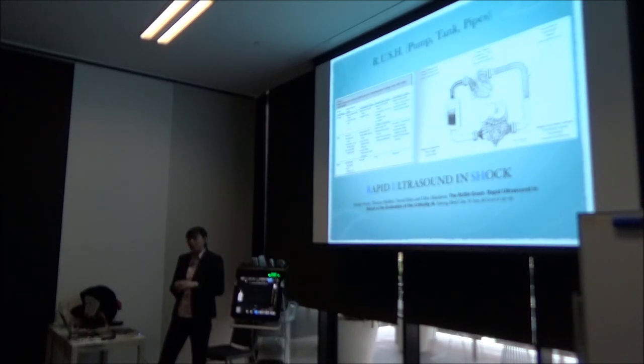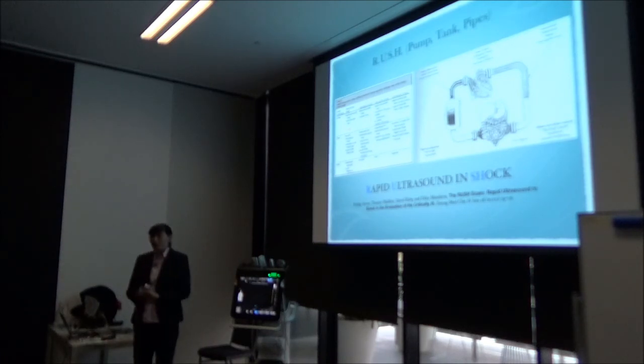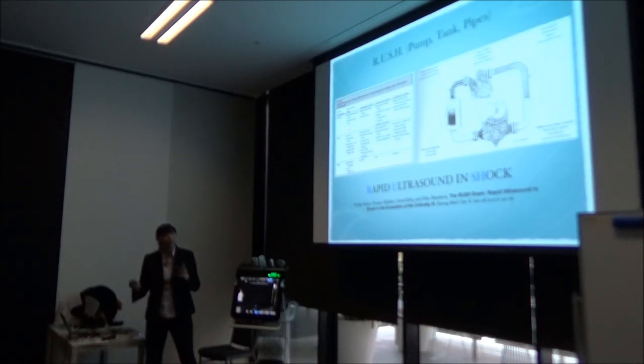If anyone here follows Scott Weingart, he has his own version where it's RUSH HIMAP, and HIMAP stands for Heart, IVC, Aorta, Morison's pouch for your FAST exam, and pneumothorax. So there's different versions of this.